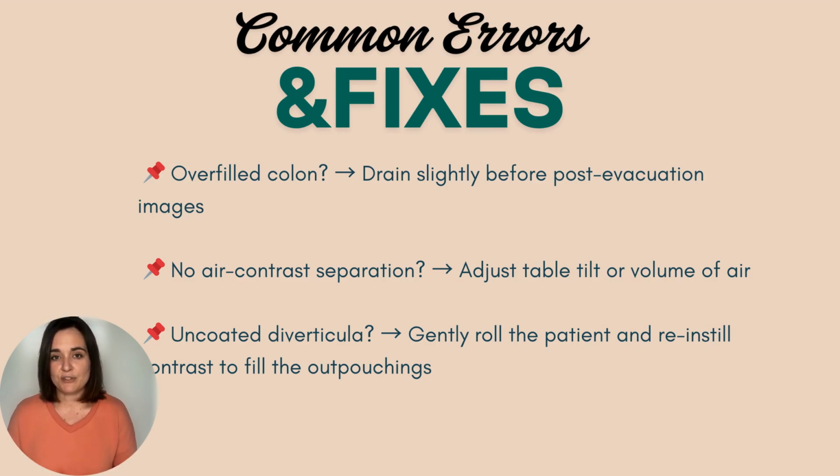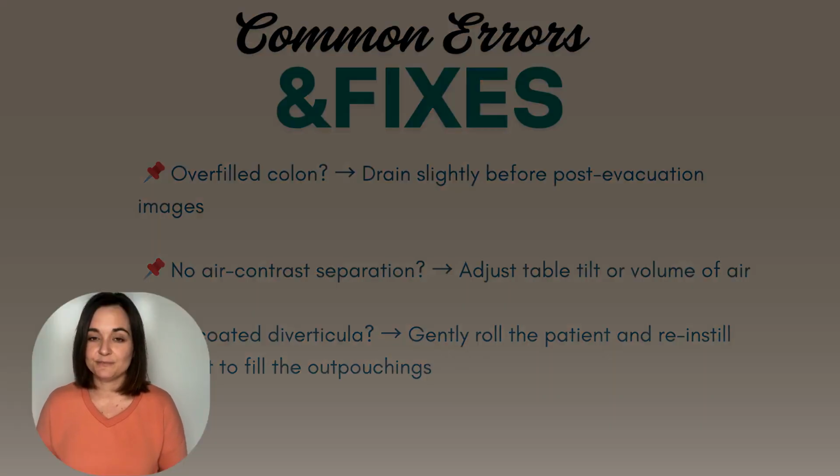Here's a tip. LPO and RPO show the splenic and hepatic flexures respectively. Flip those in your mental file folder. Section 6, image production deep dive.